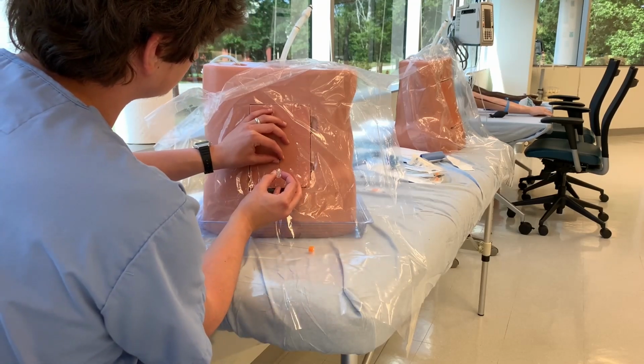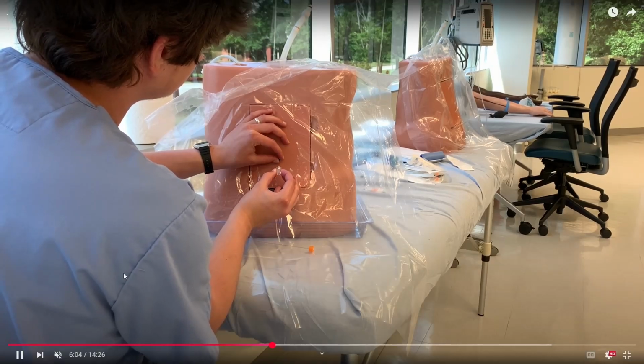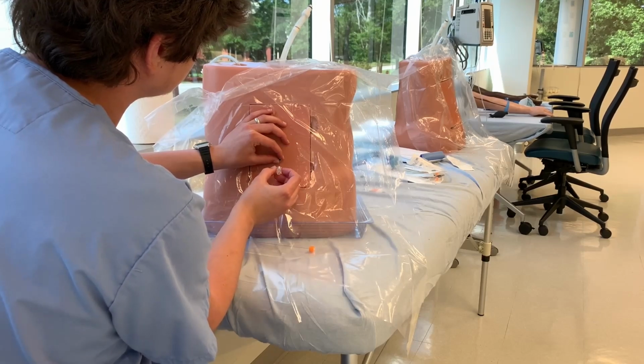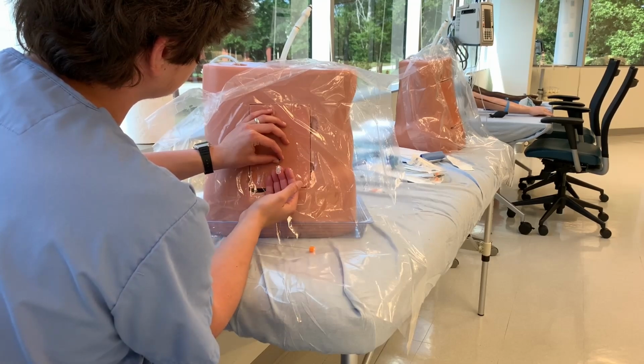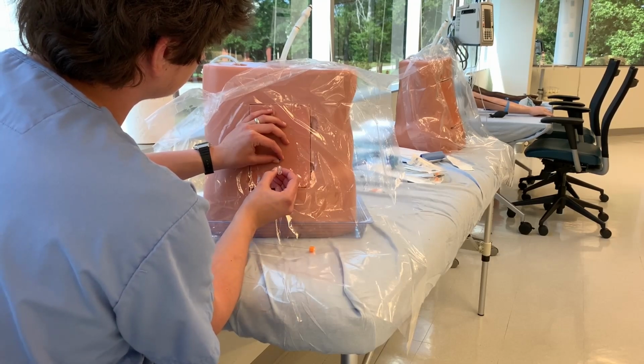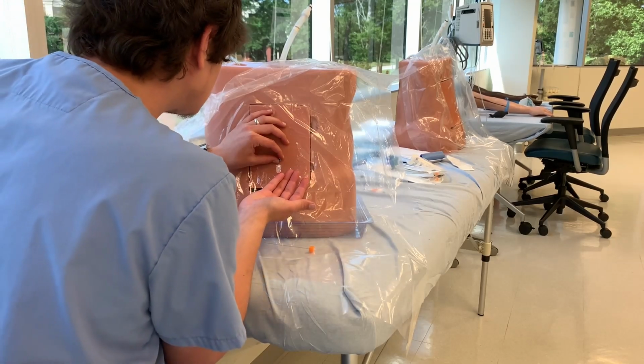Now I'm going to be stabilizing, and I'm going to be making slow pushing motions with this hand right here until I can see cerebrospinal fluid flowing back out of the needle. And I say flowing, it's going to be a slow drip. So you'll notice very tiny movements to push it in. Checking after each little push. And I see it right there.